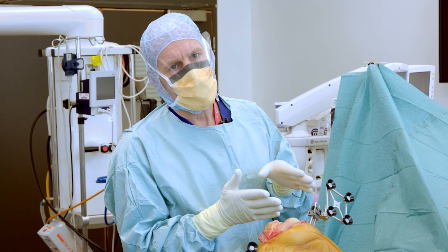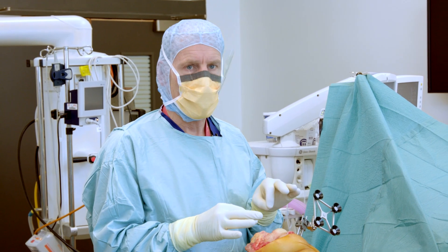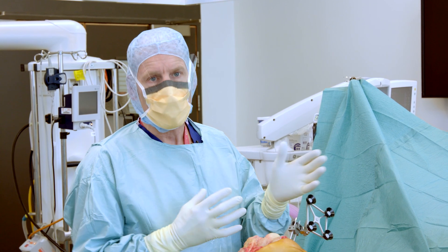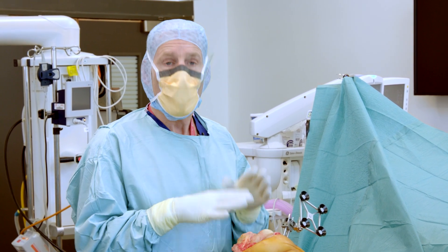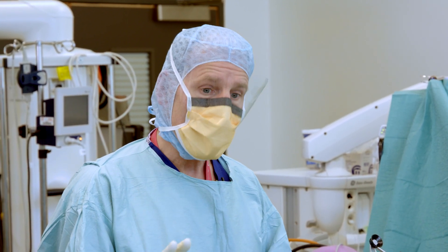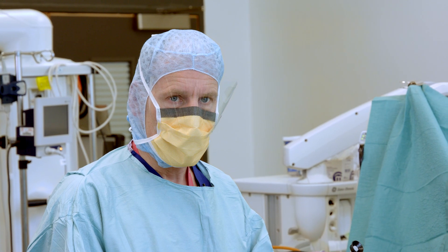The important thing to understand is we start off with a plan which we then modify based upon this particular patient's knee that we find at surgery, by measuring the tension in the ligaments. It allows us to make changes to where we intend to put the implant before we make any cuts — in other words, measure two or three times and cut once. This type of surgery responds to the situations found in theatre and we treat both the soft tissues and the bone.